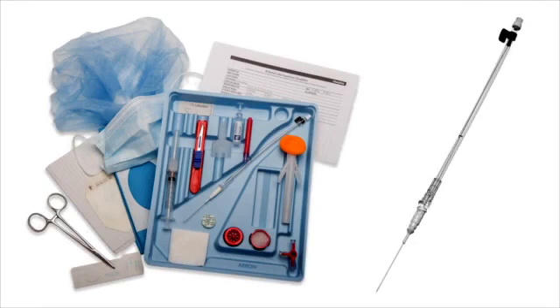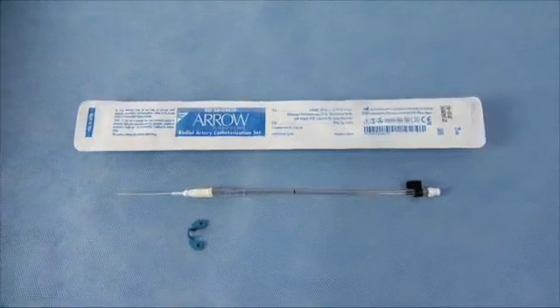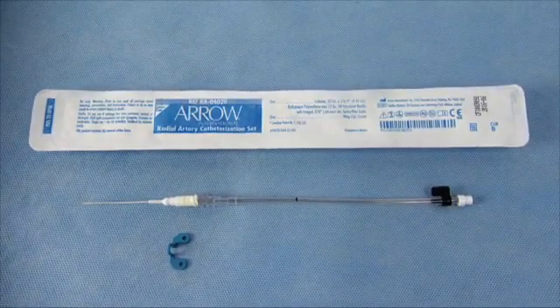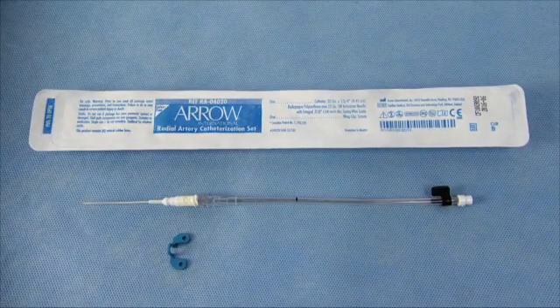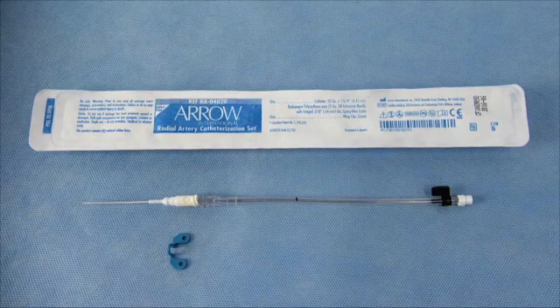This video demonstrates the insertion of an aero-radial arterial product using the integrated Seldinger technique with ultrasound guidance. Teleflex is proud to offer the first integrated Seldinger technique for arterial catheter insertion. The integrated design enables quick and easy insertions and is designed to reduce the risk of contamination and blood contact.